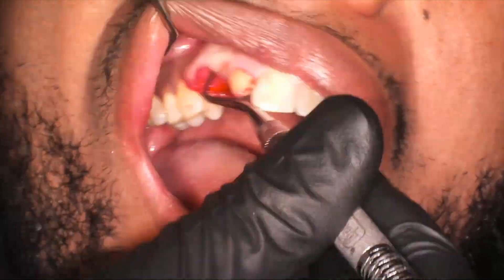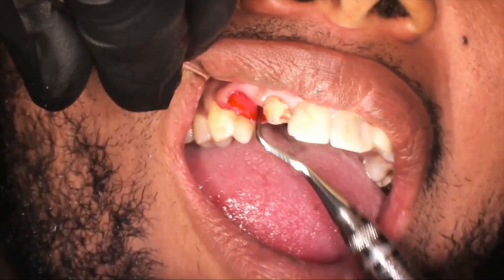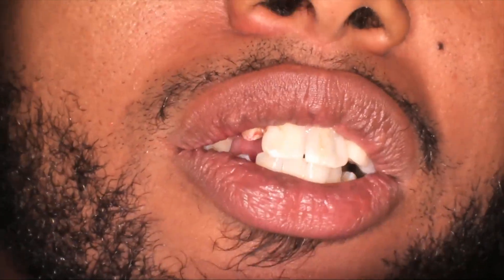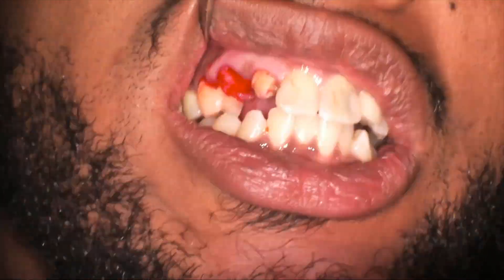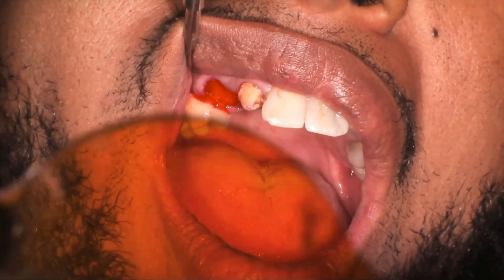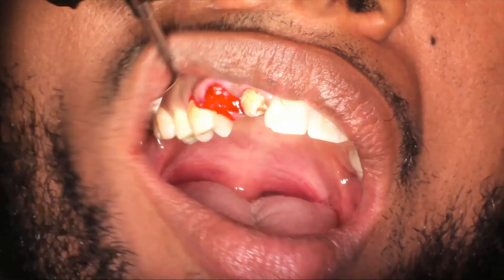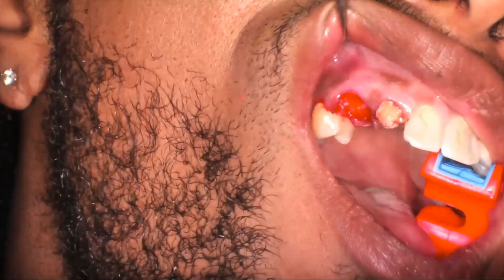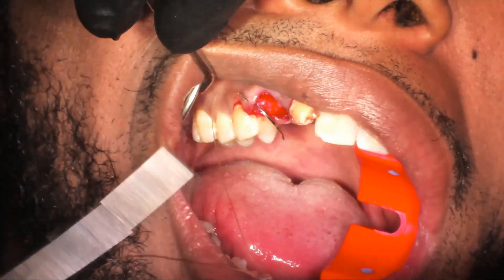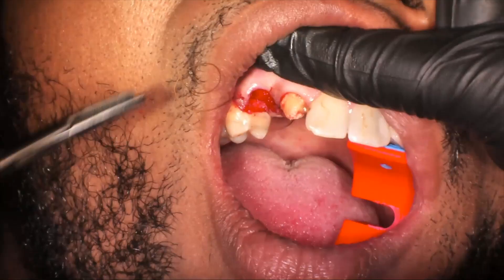Now it's basically a regular extraction socket. Like with all extraction sockets, we curette and clean out the socket, then cleanse it with sterile saline. In this particular case, we drew blood prior to starting, and we're going to place our sticky bone, which is a mixture of PRF and corticocancellous bone. Then we place some more bone there to get the socket nicely filled — not too dense — and place a couple of sutures at the site.